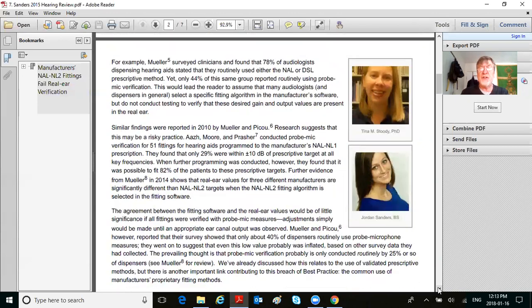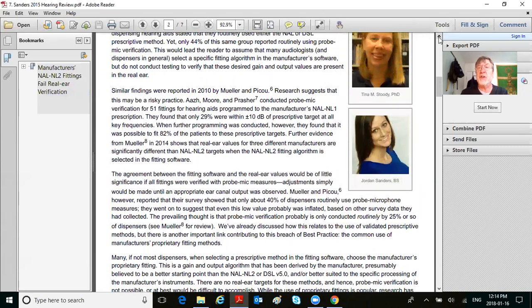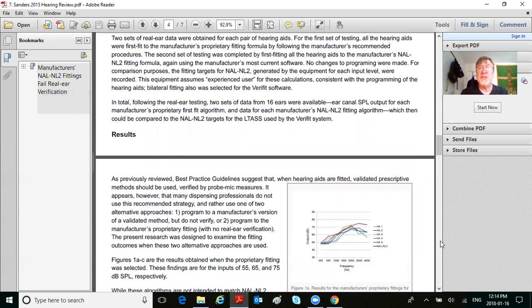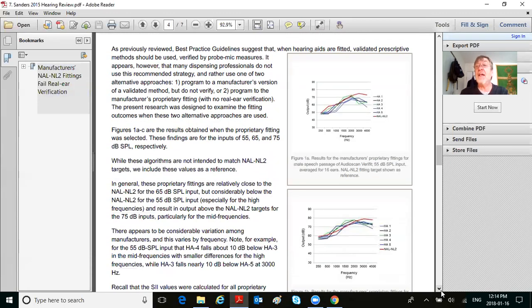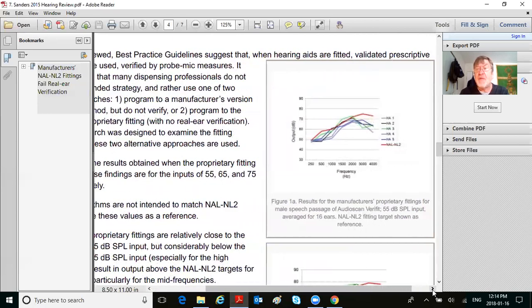But the interesting thing is when you're scrolling down here, you're going to see these authors. These are all the authors listed here. When you scroll down, you're going to see diagrams. And I'm going to be explaining these diagrams very carefully to you. Results for manufacturers' proprietary fitting methods. Now, if I blow this up a little bit, I'll pull it to the right just so you can see that better.